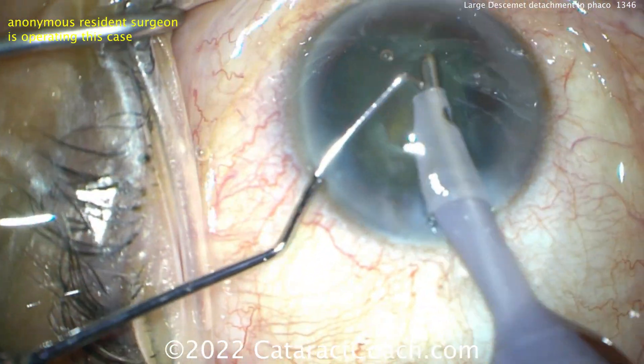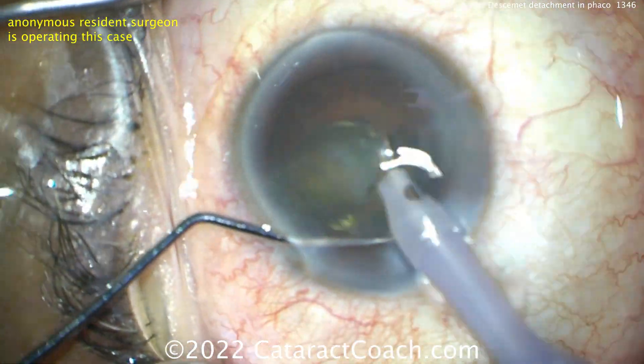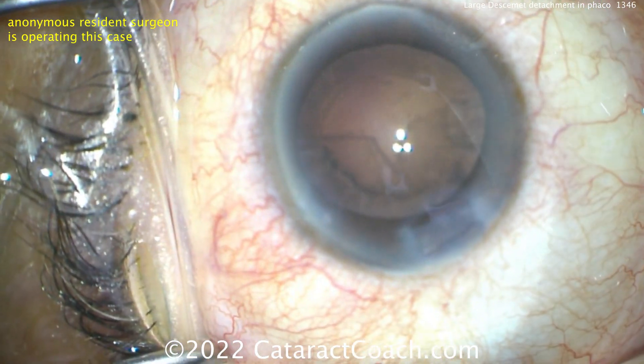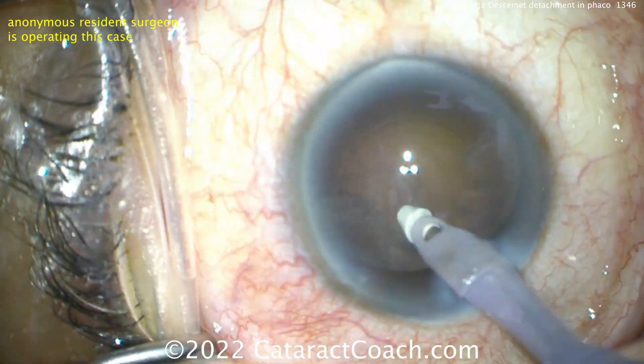With cataract surgery, there's essentially no room for error. Every step is so important. You can have a case like this with a reasonable incision, a good-looking rhexis, good nucleus removal, very nice technique — and yet still have a complication.